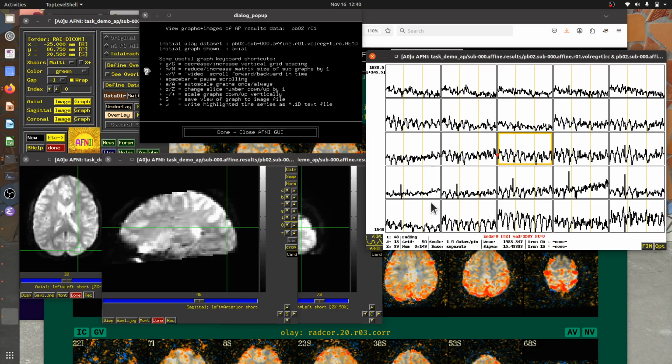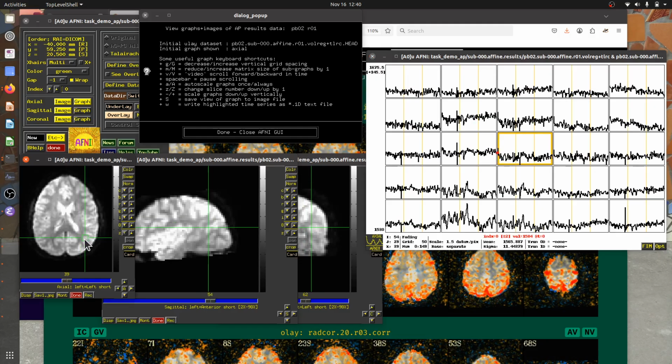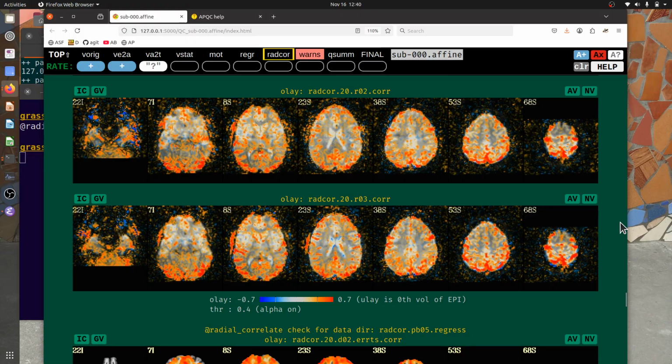There are still spikes here up and down, and actually some of them can still be reasonably large depending as I click around. And again, they'll be almost randomly up or down depending on the tissue motion and things like that. But anyways, this is just to get a sense of how the data is propagating as it's being processed here step by step. So this can be useful. I don't see anything alarming here. This level of mostly kind of local positive correlation, mostly contained in gray matter, seems pretty good.